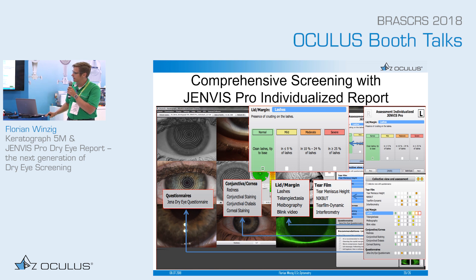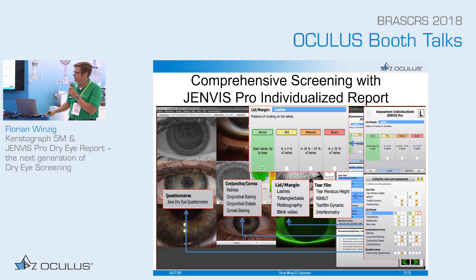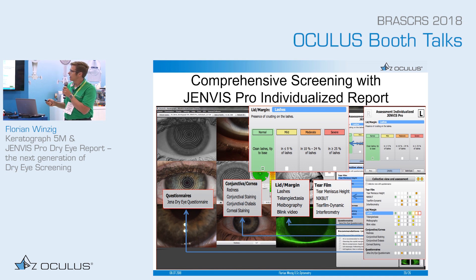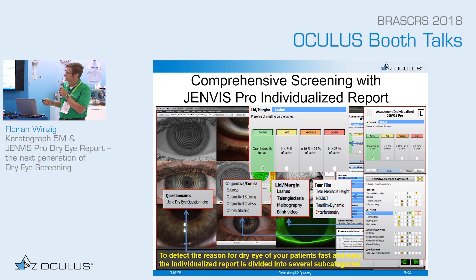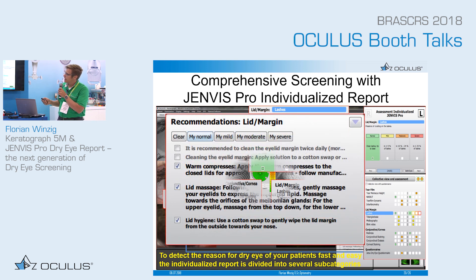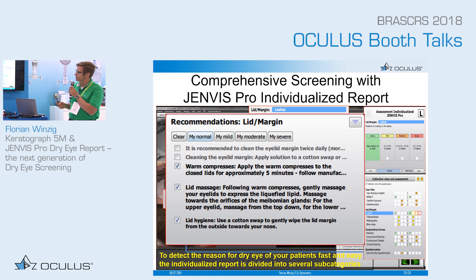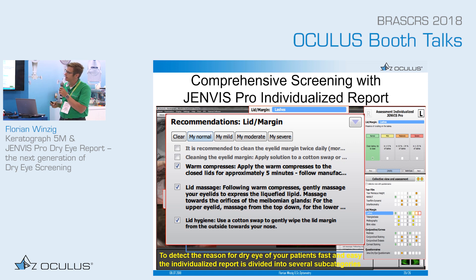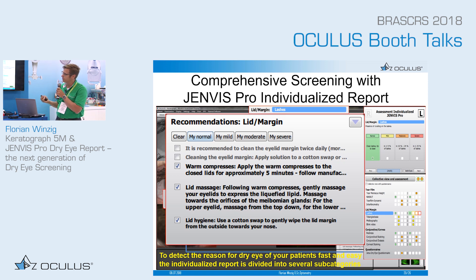The third subcategory covers conjunctival and corneal findings, mainly conjunctival and corneal staining and redness. The fourth covers subjective symptoms recorded in the dry eye questionnaire. Once assessment across all subcategories is complete, the recommendation field appears, allowing you to activate treatments or advice for the patient's dry eye condition with a simple click.